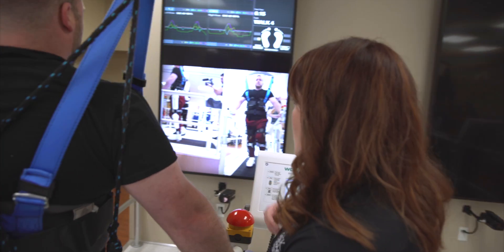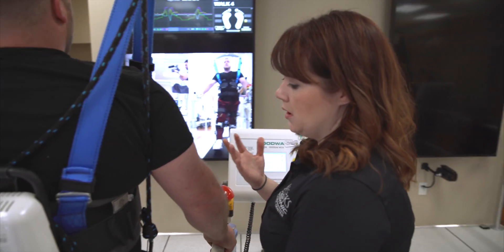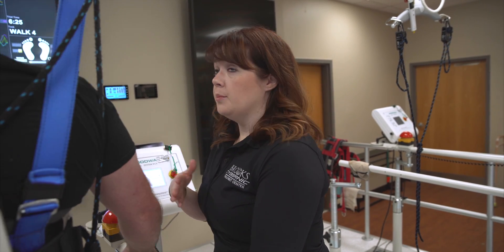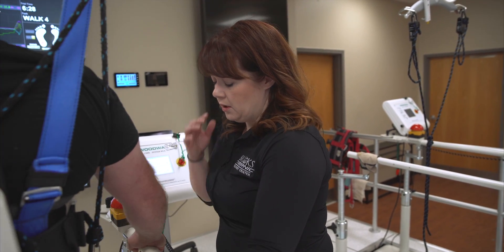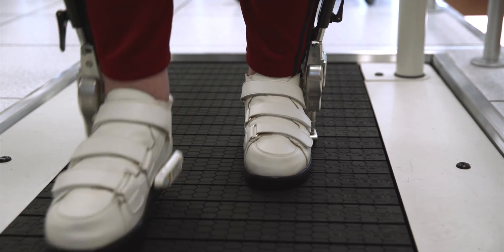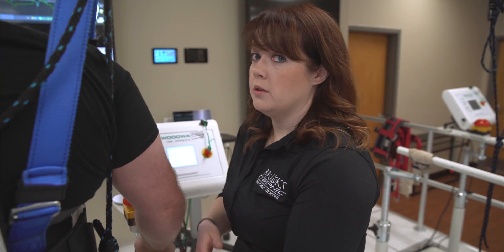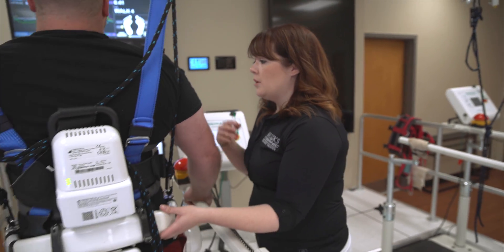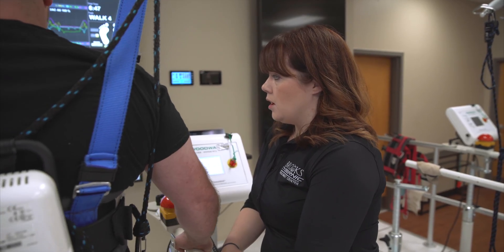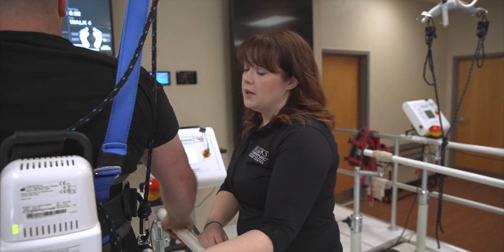We've got cameras — one in the front so that he can have a front view, which is particularly important for weight shift and just to keep a sense of where their body is. Particularly when someone doesn't have sensation, having that visual feedback is really important for them to be able to make corrections to their step or their posture that they may not be able to feel. We also have the side view camera, which is particularly important for step length and also posture, to help make those corrections.